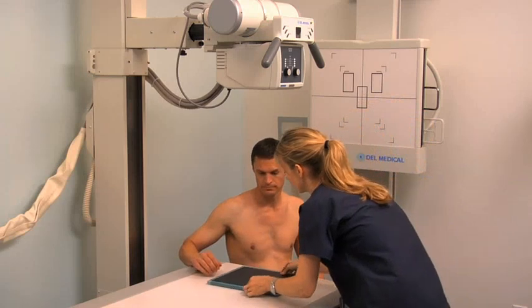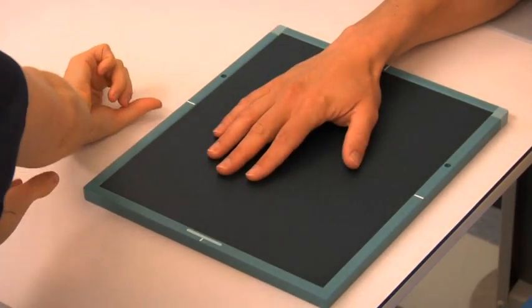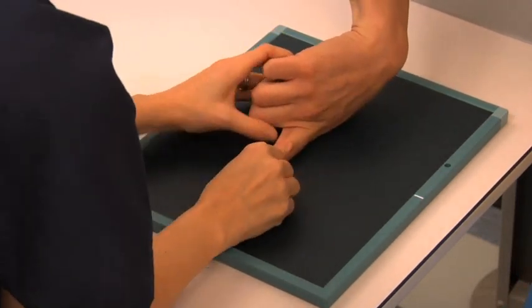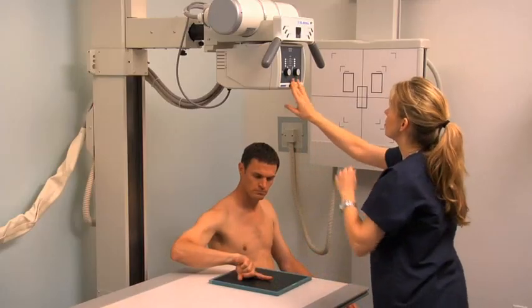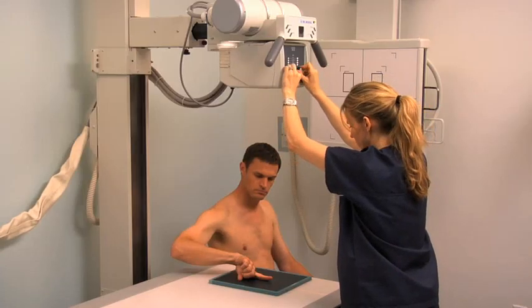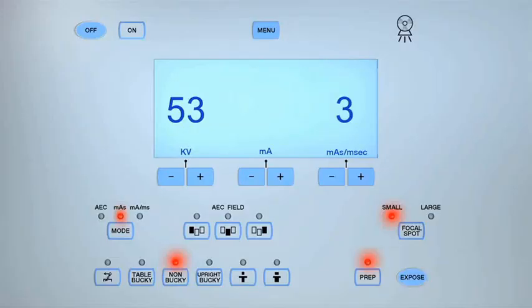For a lateral projection, rotate the patient's forearm and hand medially, resting the finger on its lateral aspect on an 8-by-10-inch cassette. Center the central ray to the interphalangeal joint. Collimate the light field as in the PA and PAO projection and expose the cassette.